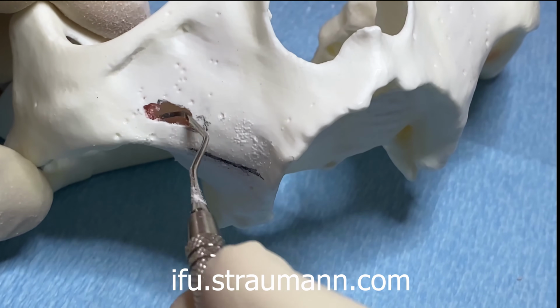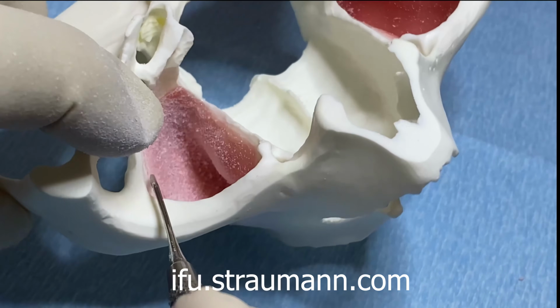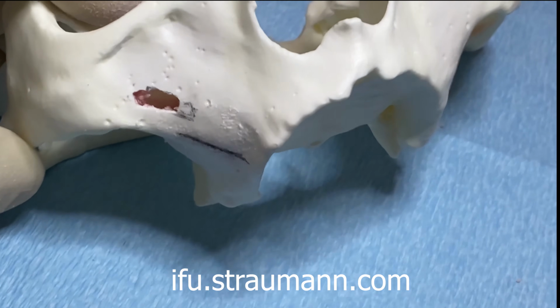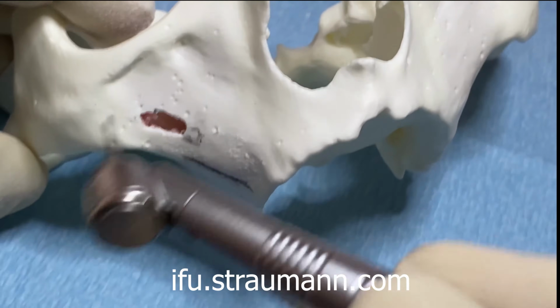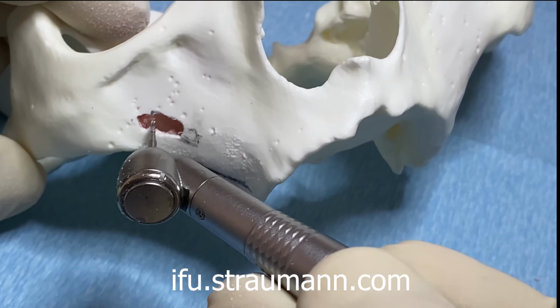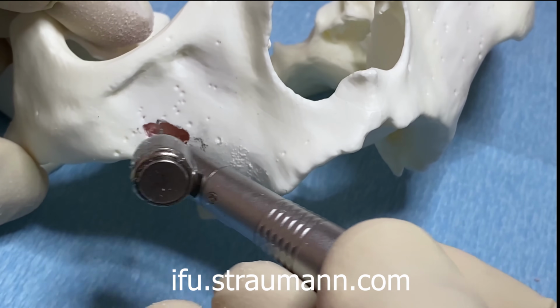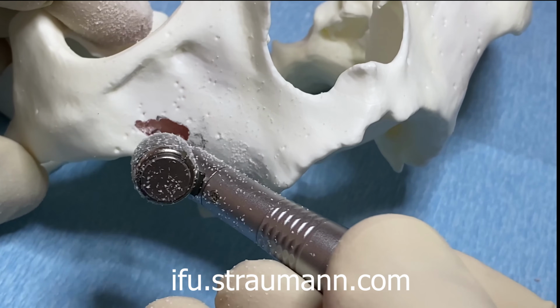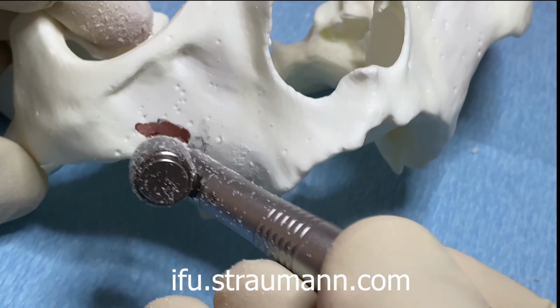And this is the membrane that's inside the model. So obviously the Schneiderian would be a lot more delicate. So again, just to kind of have a clear path, we can go ahead and try to see if we can get the Schneiderian or a little plastic Schneiderian out of the way here without damaging things too much.